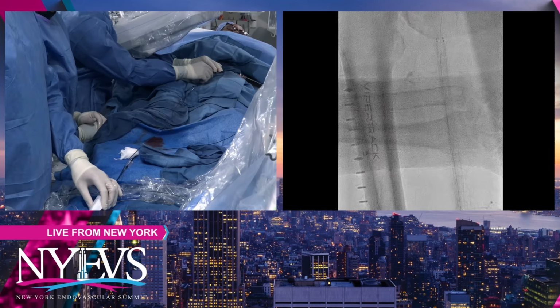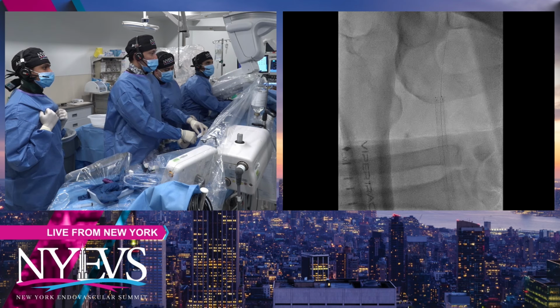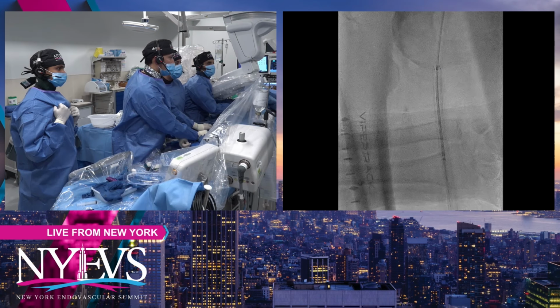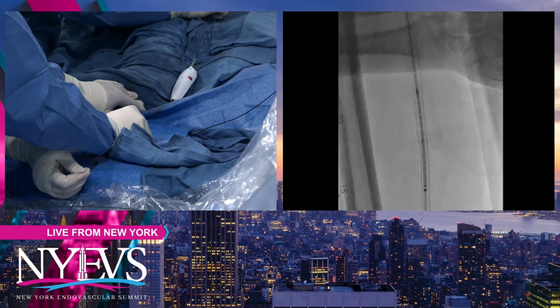So you've already DCB'd this, and now you're going to put in a drug-coated stent, I'm assuming, in the middle area. Is there any danger with the drug dose if you use double at the level of the upper lesion?